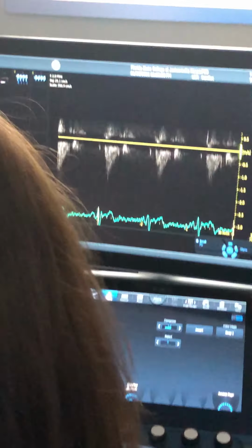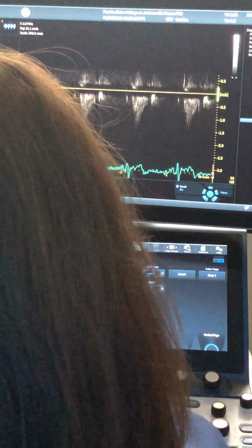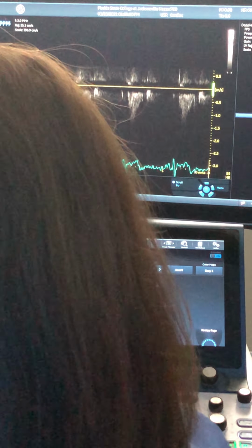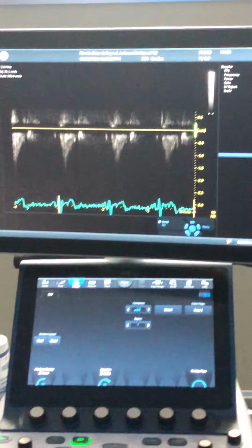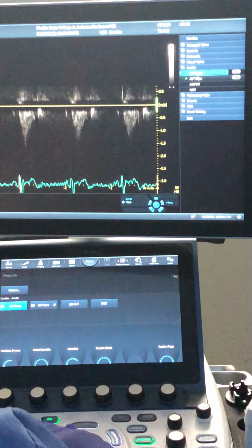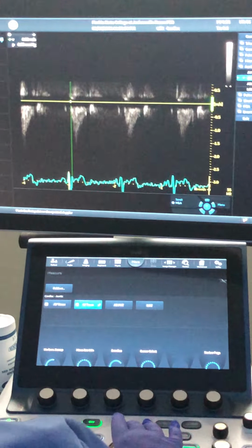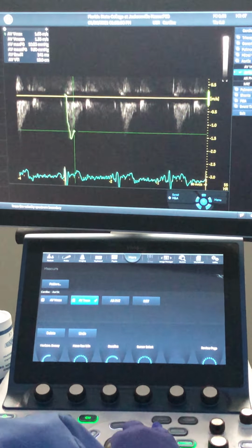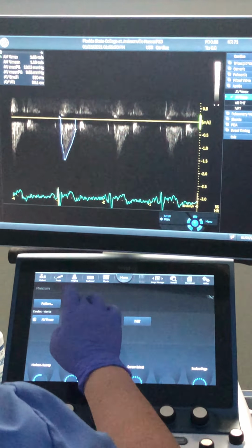So what I was doing is this line is coming out here, and I'm kind of moving it up, out. If her mitral valve is down here, her aortic valve is up here. So it's just more anterior. So now I'm going to measure, and I would do the same thing, aortic valve trace. And then what you should do before is annotate.